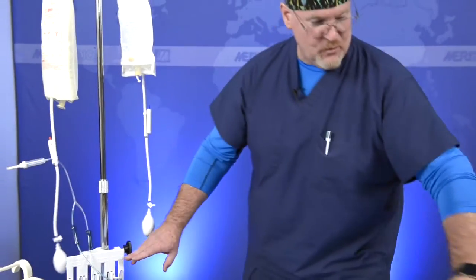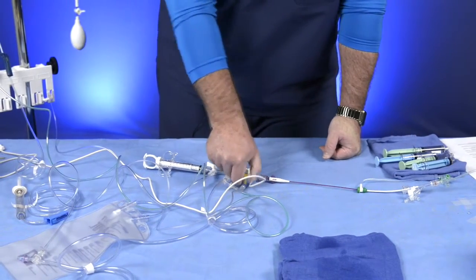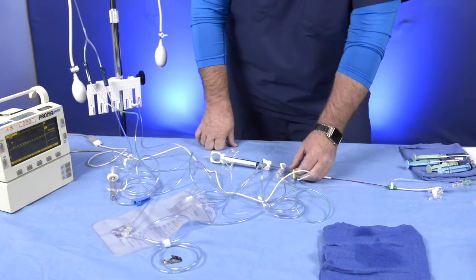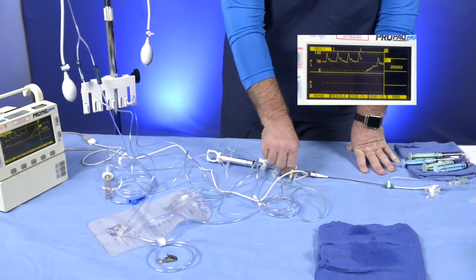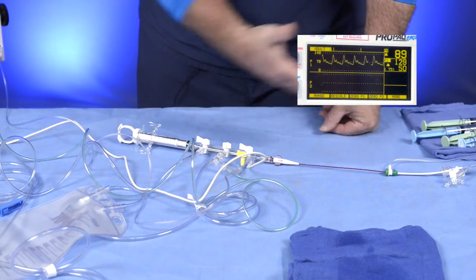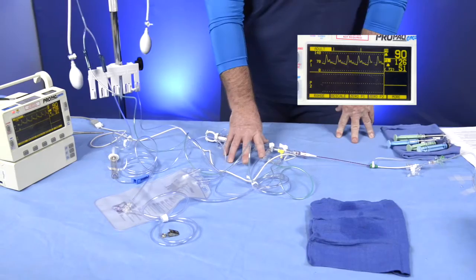We pass this off to the circulator. This will be hooked onto your IV pole. Once this is hooked on and leveled with the phlebostatic level of the patient, you don't want to mess with it — leave it right where it's at. We want to open to the atmosphere, then call up to our monitoring individual behind the glass and tell them to go ahead and zero our line. After they've zeroed, we turn off to the atmosphere and on to our patient. By turning this from straight up and down, when we zero to the right, it puts us on to the patient and off to the atmosphere.